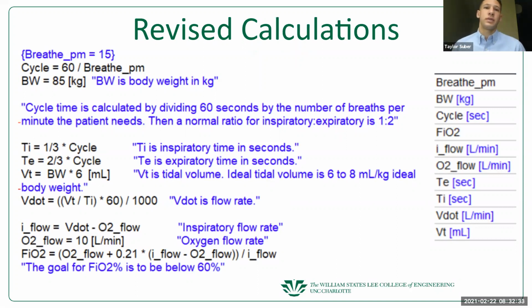The calculations are done based off of the breathing rate. So whatever the breathing rate is set to is how we'll determine our cycle, which will be an inspiratory time and expiratory time. And then from that, we can calculate our tidal volume and flow rate. So you can go to the next slide.